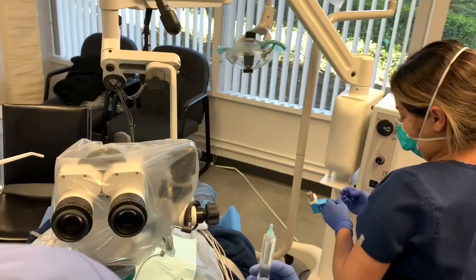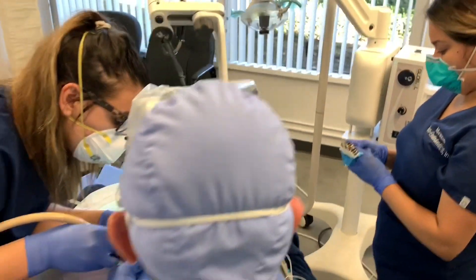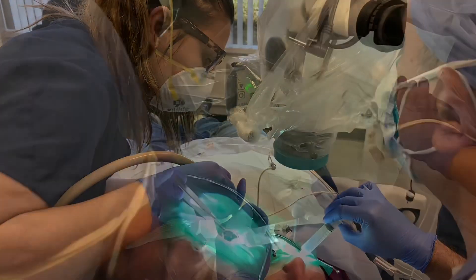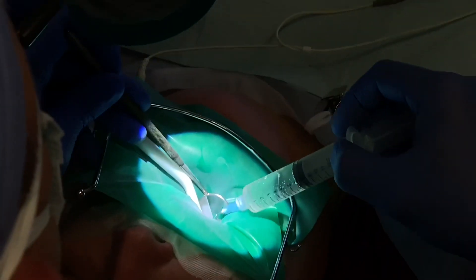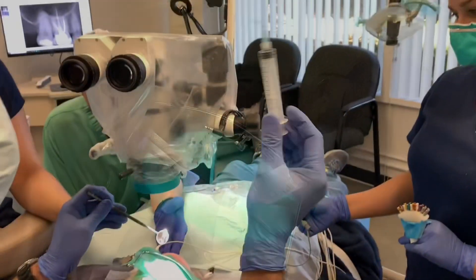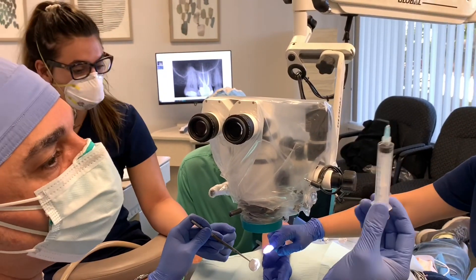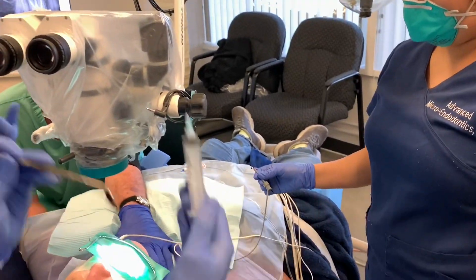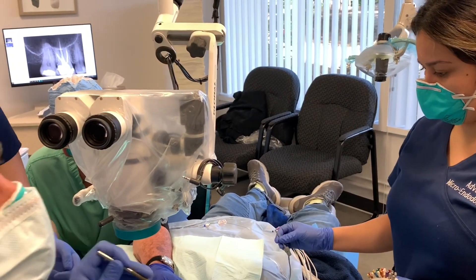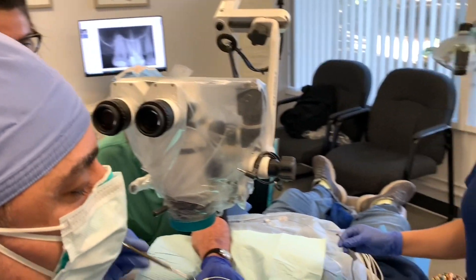I use blue needles to remove the bulk of the pulp tissue. I finished one 12cc syringe of full-strength hypochlorite, flushing out all the bits and pieces of pulp tissue that were in suspension in the chelating agent — it's all out now.